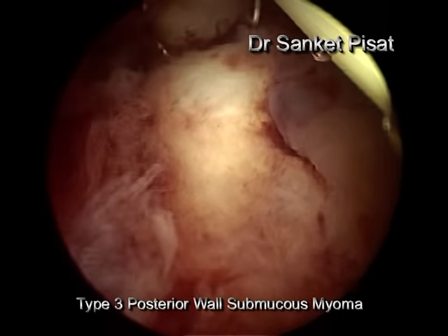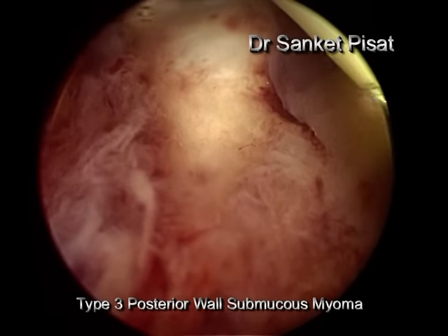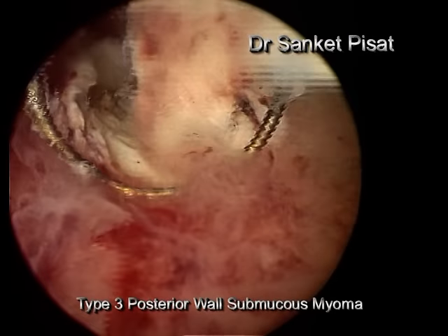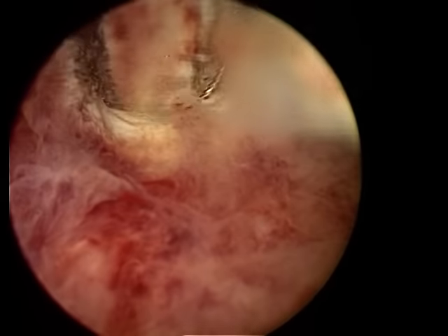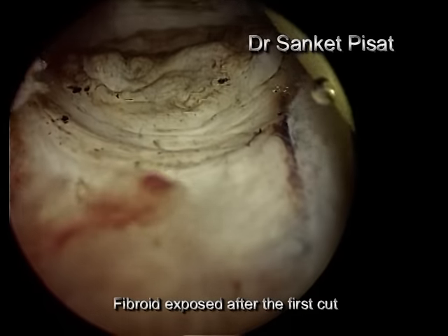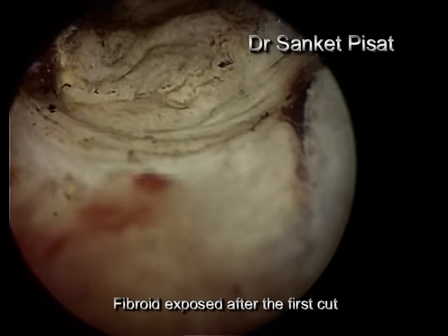This is a patient with a type 3 posterior wall submucous fibroid. The fibroid is only slightly jutting or touching the endometrial cavity, but most of the fibroid is still within the uterine wall. It is only after the first primary cut has been made that the fibroid is seen.